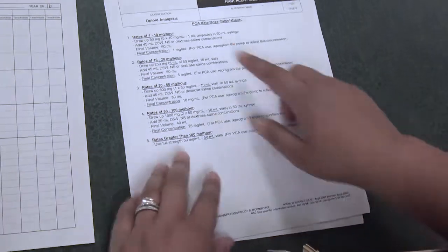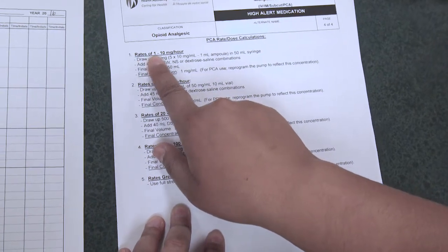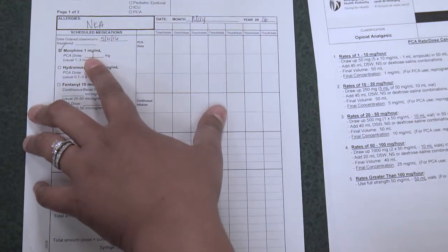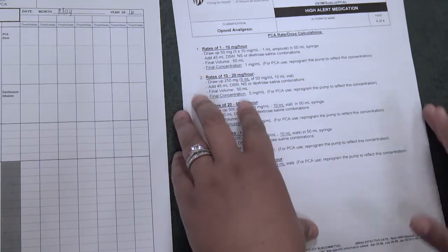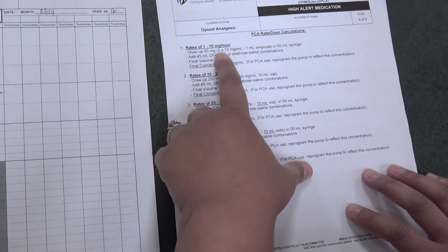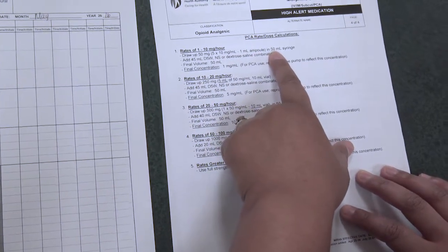Now we have PCA dose calculations. The first one says rates of 1 to 10 milligrams per hour. As you can see on the physician's order, the PCA dose is 1 milligram, so this is the one that I'm going to follow. Let's read it so we have an understanding of what we need. Draw up 50 milligrams, so 5 10 milligram per milliliter ampules in a 50 milliliter syringe.